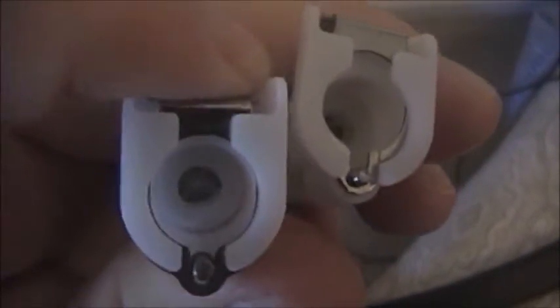Now, going down here, we have this little rubber hose to those infamous connectors that gave me so much trouble. Basically, if you need to refill it with ice, which we don't anymore because we use the water bottles, you just push these and it'll come off. Now, my problem was I didn't have enough strength, and I probably won't one-handed, to actually connect these up again. There's a little metal switch here that you have to push hard and activate and make sure that goes all the way up. If it doesn't, again, you're going to have problems with it leaking like I did the first night.